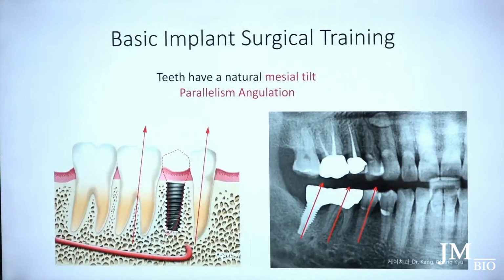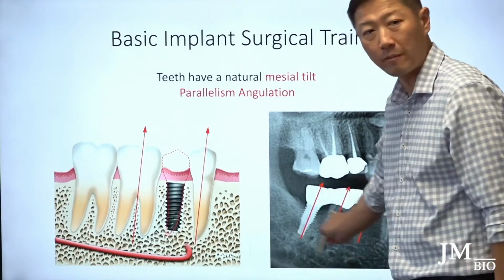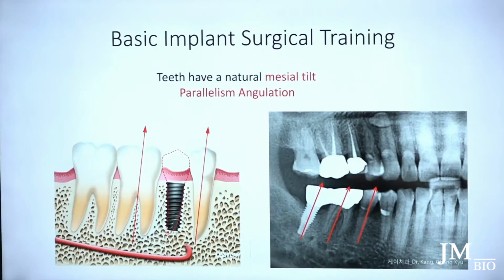So, maintaining parallelism, this is a very well-placed implant. Look, it's very parallel to the tooth in front of it. That's what you want. That's very ideal.